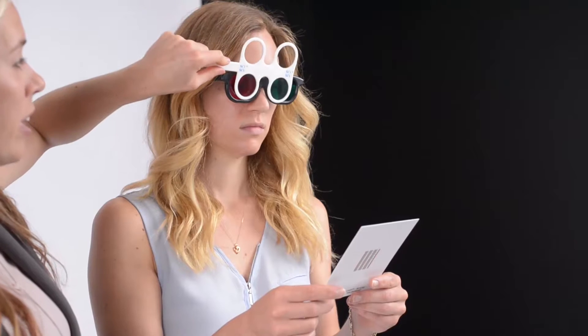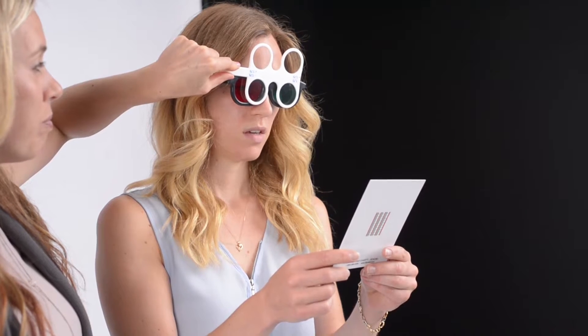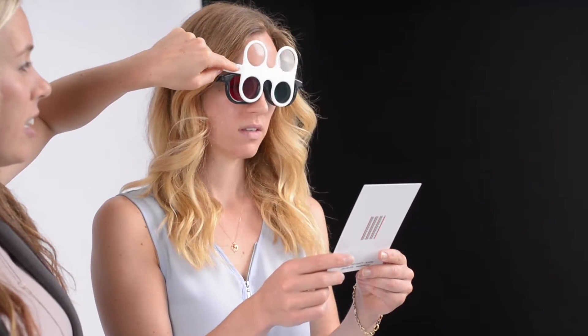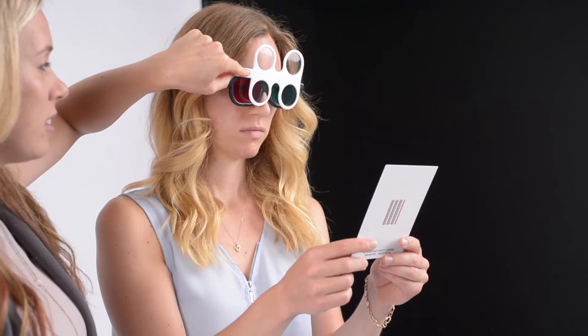So, you want to start by putting the minus lens over your eyes and feel your eyes focus hard as you're reading the first row of letters to the beat of the metronome. As you switch to the next line, you can go to the plus lens, feel your eyes focus soft, and make sure you can see through all of the bands and read the letters to the beat of the metronome.